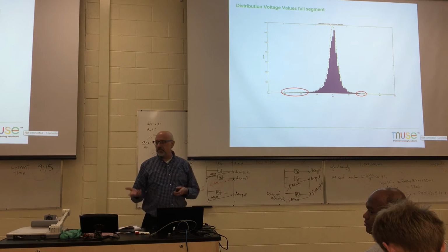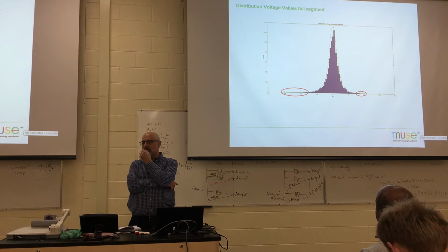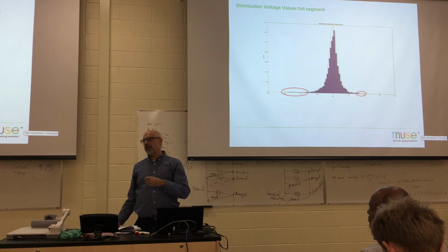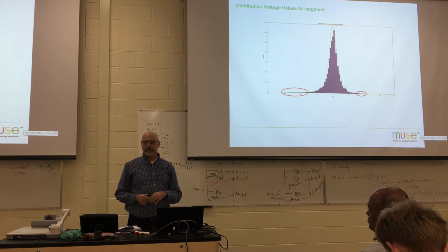Sorry, I have a question. Sure. I see that your voltage is from about -300 to about +300. Is that the blinking that you'll see then? So at the end, that's your blinking, the peak to peak? Yeah, the blink will have a strong negative voltage, the way our electrodes are configured and located. That's right.